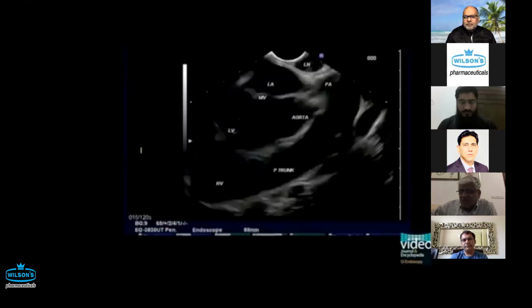It's one of the best there is by Rob. But there he mentions one thing, and I think that's something that I find very useful: if you lose your area and you're not sure at whichever station you are, you go back, restart. Don't waste time without understanding the anatomy or at least some organ, because then you keep on messing it up, especially in the early days. Otherwise, once you get into it, I think EUS is relatively straightforward in terms of what you can see and how you can get those views that you need to see.